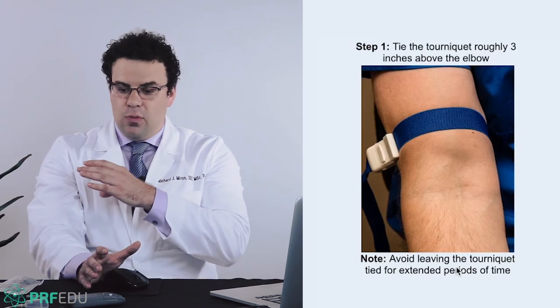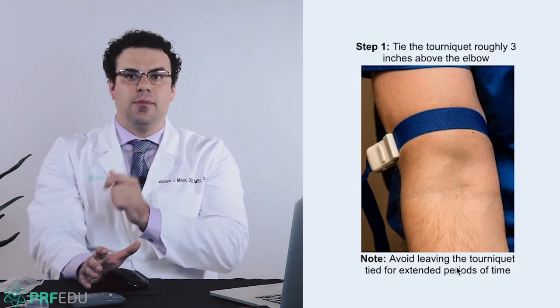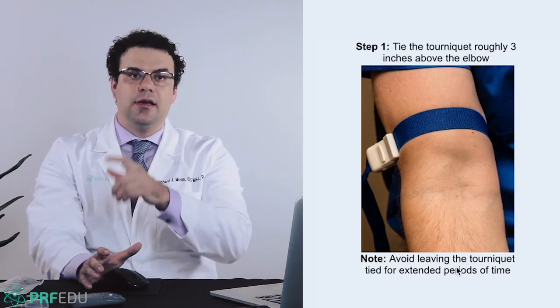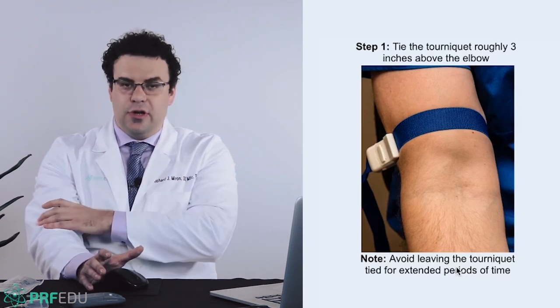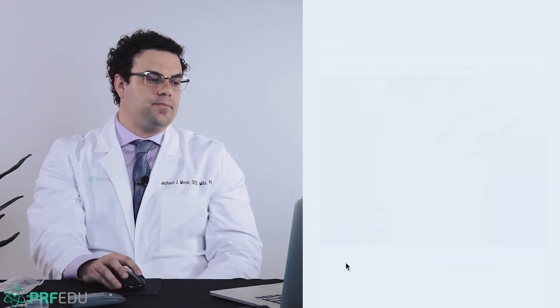Okay, so always when you put the tourniquet on, you got to be ready. You got to be ready to go. Okay, you got to have all your equipment ready. Centrifuge is set. You've already maybe located the vein with the vein finder. Tourniquet goes on and then you go through the procedure.